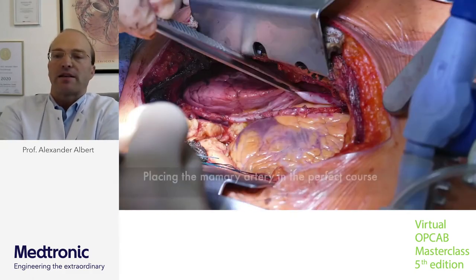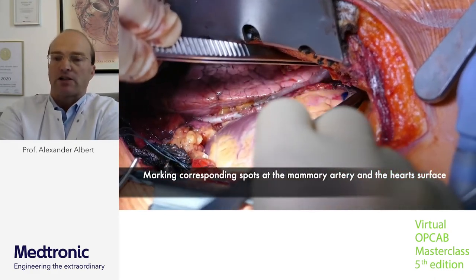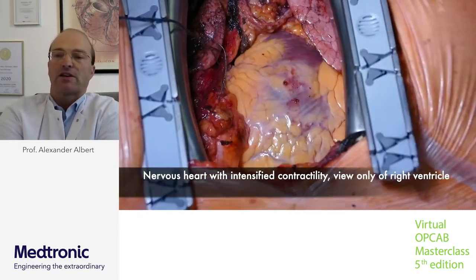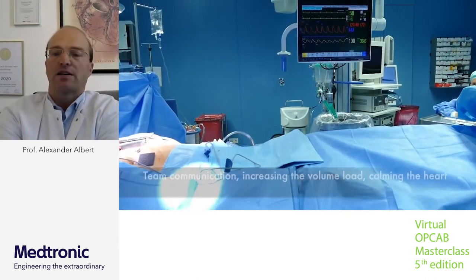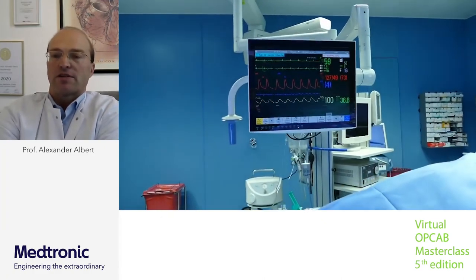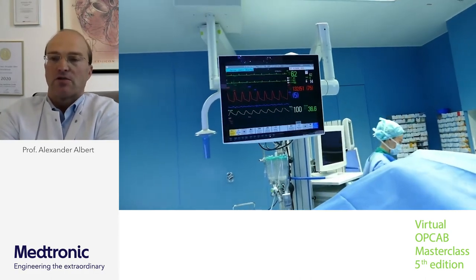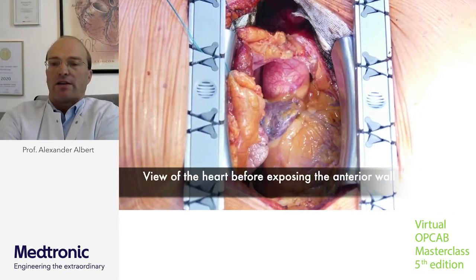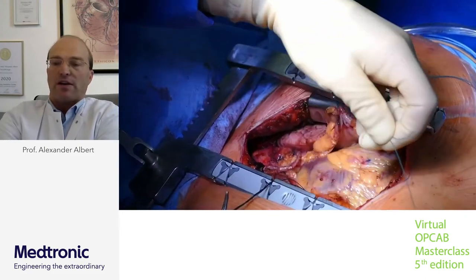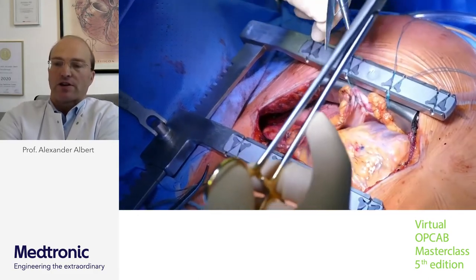Before bringing down the mammary artery, I visualize the anterior wall without touching the heart. I cut the pericardium to allow a perfect curve of mammary artery in an inverse-T form. I place the mammary artery parallel to the LAD and mark a reference point on the heart surface and on the mammary artery — two reference points — so wherever I perform my anastomosis, I maintain the perfect mammary artery curve. I then want to increase volume to calm the heart, as strong contractility causes stress. I bring down the left ventricle's anterior wall without touching the heart, only using sutures according to Professor Sajan's technique.